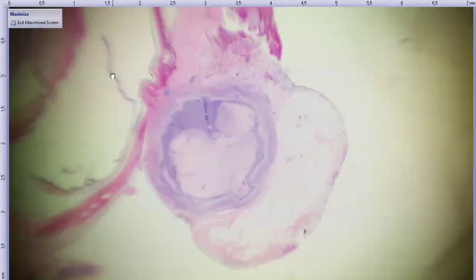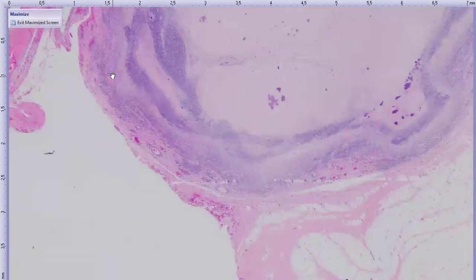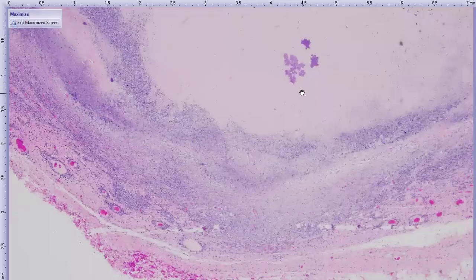The rest of the eye is actually relatively quiet. This purple stuff up here, sorry, it's out of focus, is actually some lacrimal gland, which could be the main lacrimal gland or some accessory lacrimal gland. I'm not sure. But anyway, this is the main event, as Megan Klimans likes to say. So we're going to jump in there. Okay, so from this magnification, once again, you can see there are these swaths of more purple, this pink stuff, and then there's a more well-defined punctate purple stuff going on there. As we go higher, not too much different there.